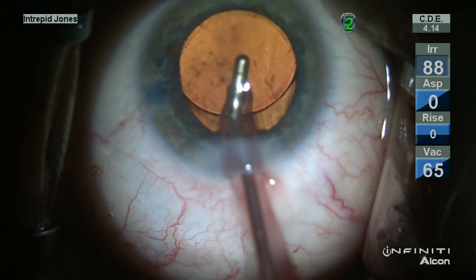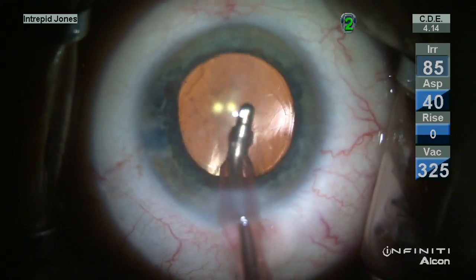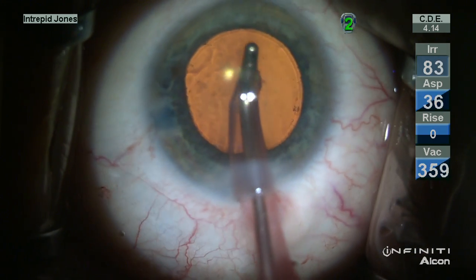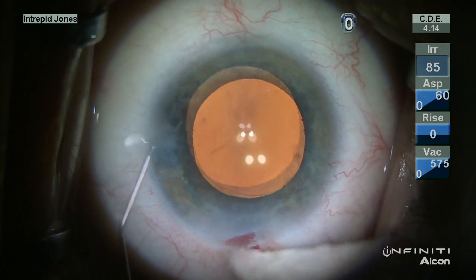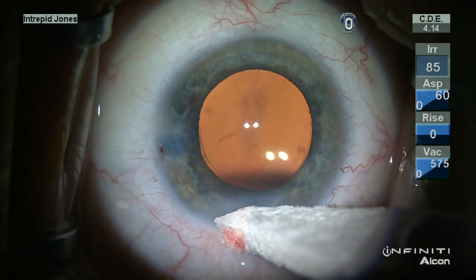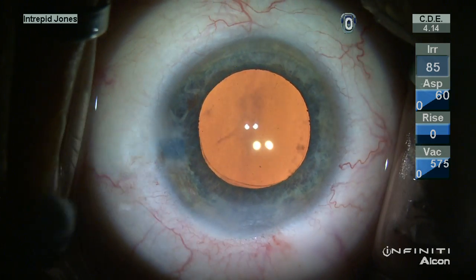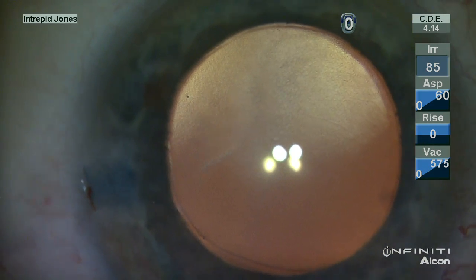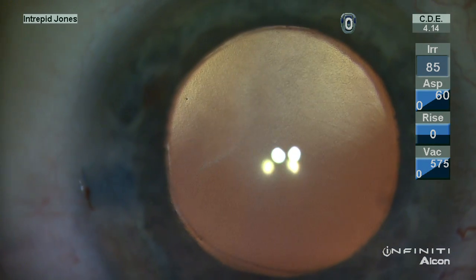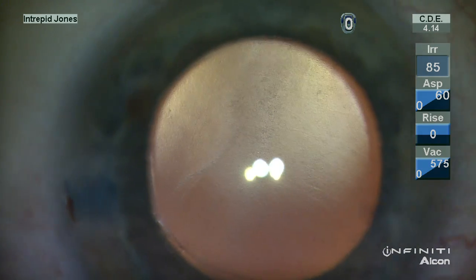The viscoelastic material is then evacuated from behind the intraocular lens, and here you can see that the endothelium has been protected throughout with viscoelastic. The wounds are hydrated and checked, and the pressure is titrated. Here at the end you can note that there is a granular appearance to the corneal tissue — this is the guttata of the endothelium.